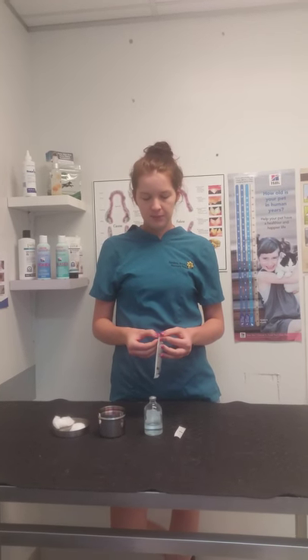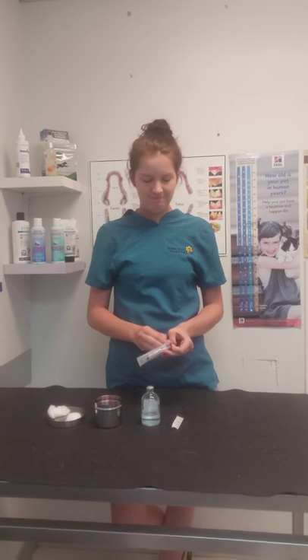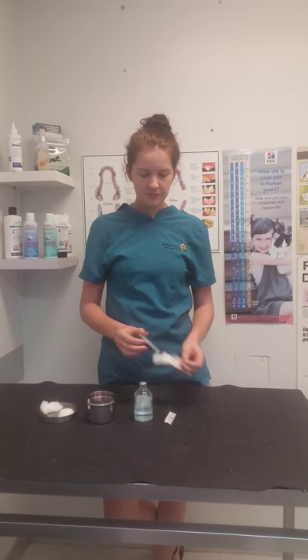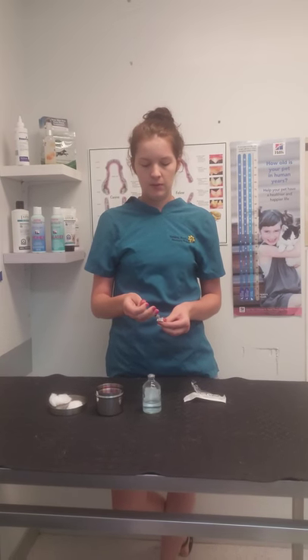First we can take our syringe and open it aseptically. We can also take our needle, open it and place it on the syringe.